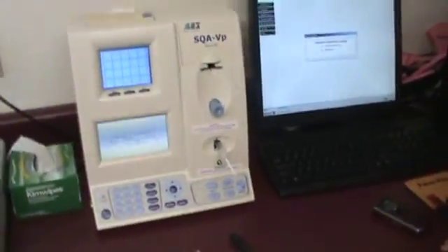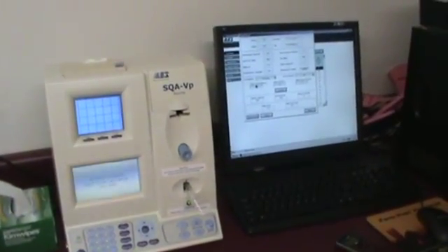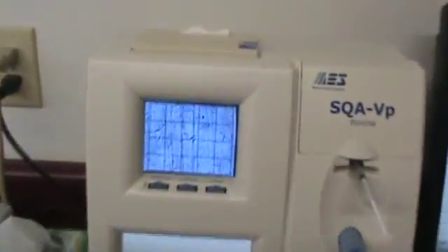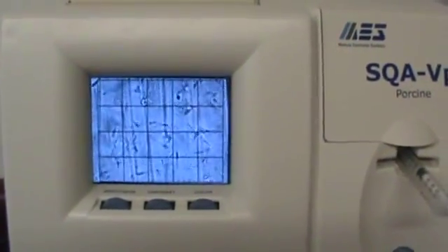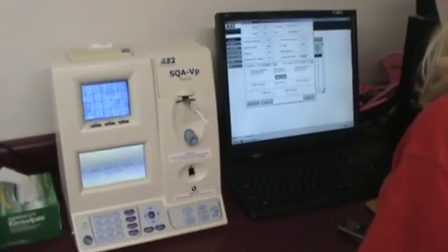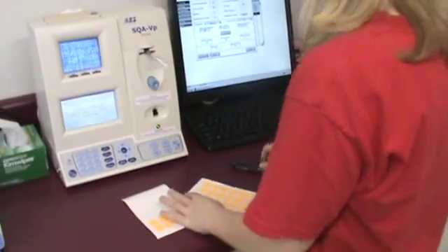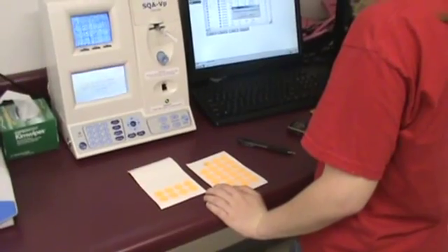Marissa is now pulling up the results. One of the good things about this computer is that most people processing semen put in a certain number of billions of cells per dose, but we can kind of do that backwards here — we can actually look at the semen quality before we determine the number of doses. As we can see here, this collection is swimming really well, so Marissa is going to make 16 doses from this collection. She'll write down the numbers on the little orange sticker, which will show the volume of extender that needs to be poured in as well as the number of doses to be made.